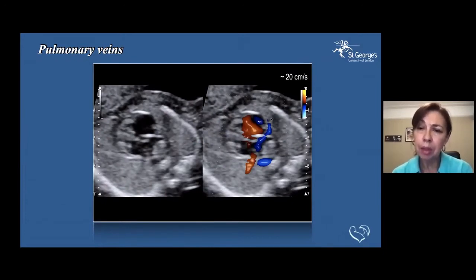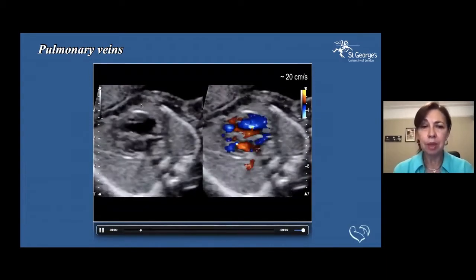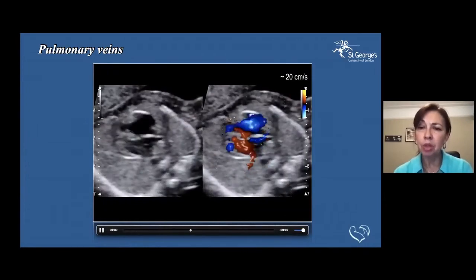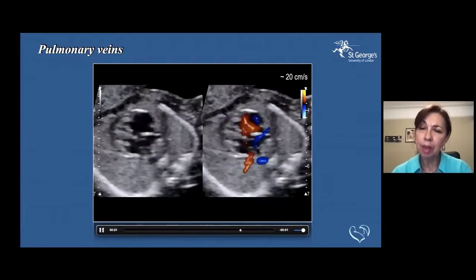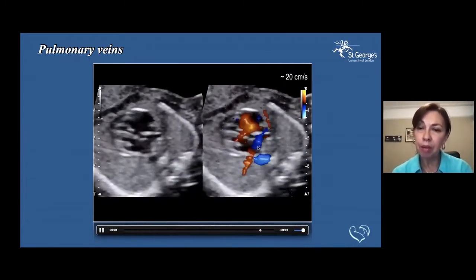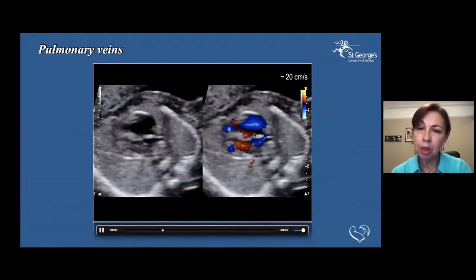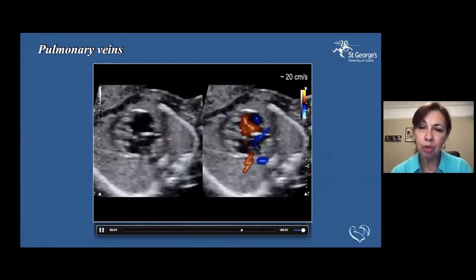If we have abnormalities of the pulmonary venous return, the veins actually come very close to the atrial chamber. So if you don't have this image on one side of the screen, and if the underlying image here is not very clear, you may think that the veins are coming into the atrial chambers, but they could be coming to a confluence on the back of the atrium. The other point is that it's important to see where the atrial septum is, and here it's very clear, but it's not always the case. So you want to make sure that those veins are actually entering the left atrial cavity.